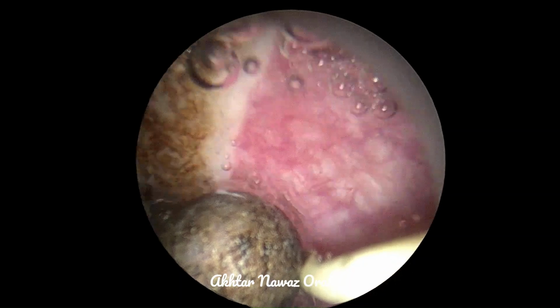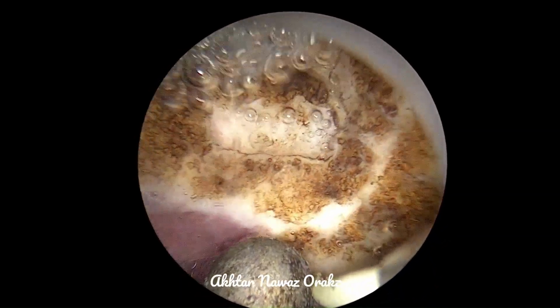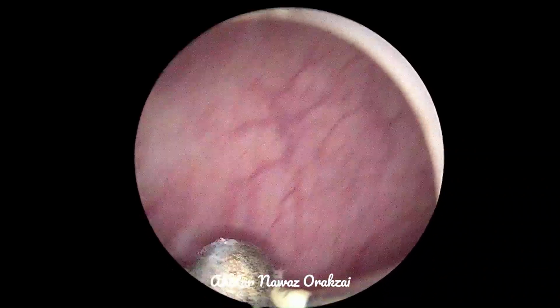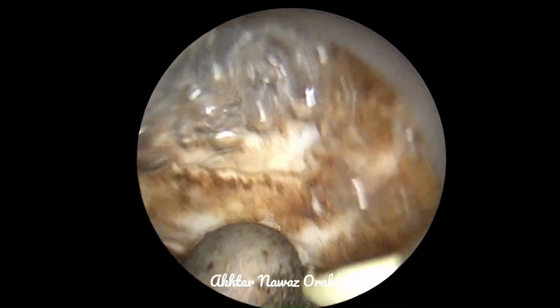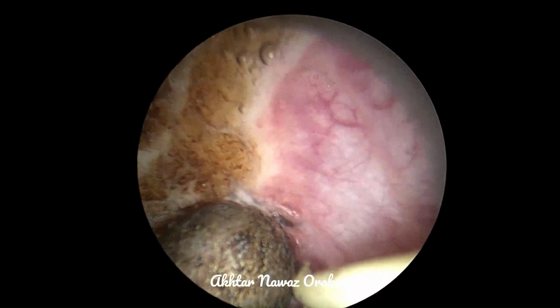So this is the way to perform Check Cystoscopy. If we had not done it like this, we might have missed this tumor. So always a proper map of the bladder has to be followed.